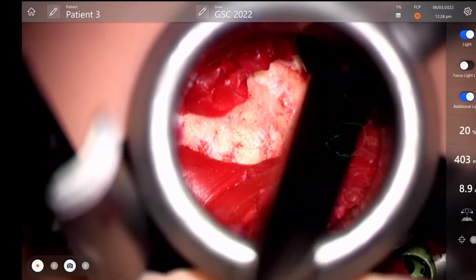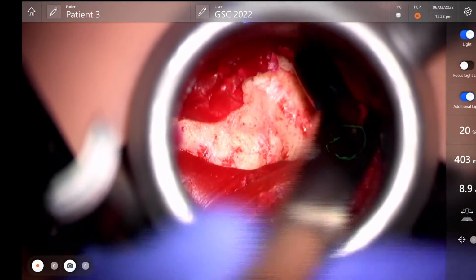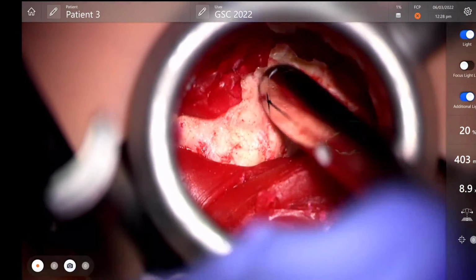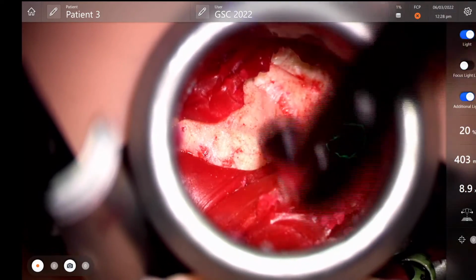So I'm a little bit lateral with my tube. Actually can do this too. Do you see that blue structure? Can you see that? Can we see that on the screen? Does that project?